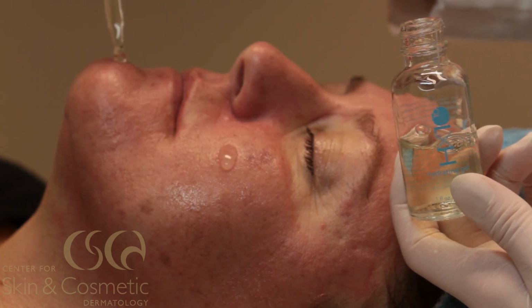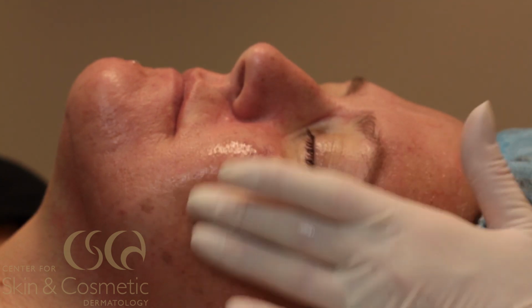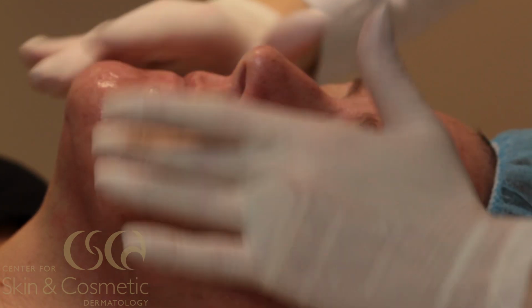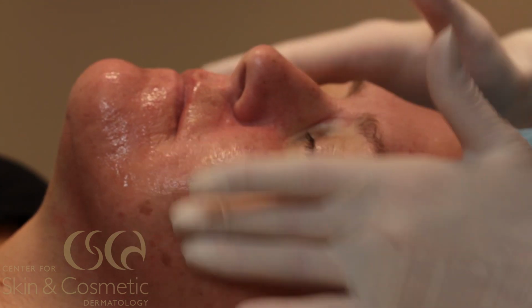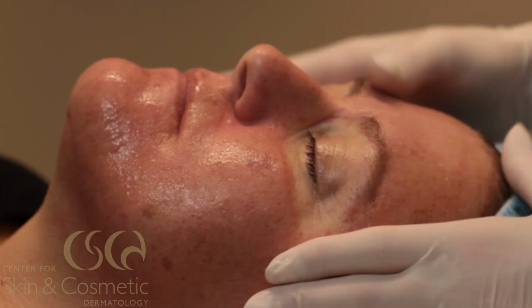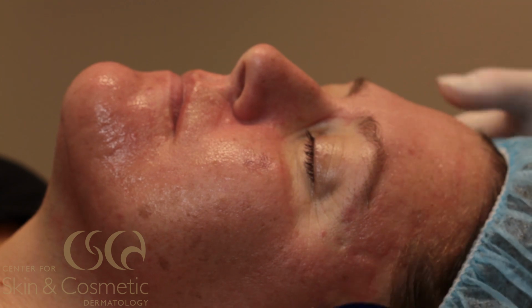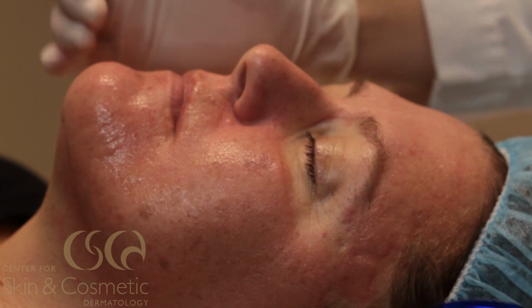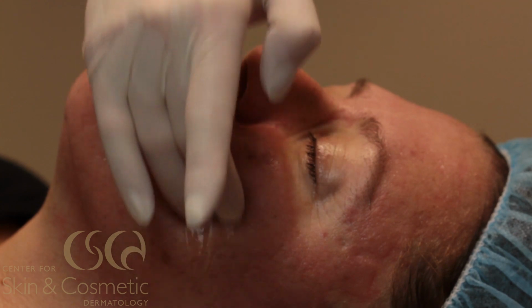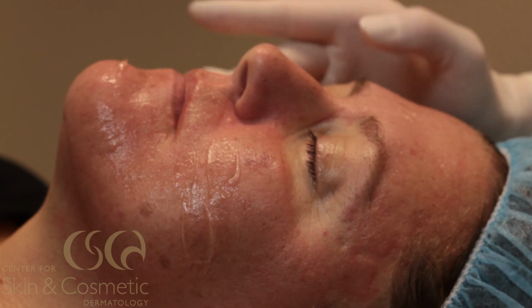Immediately post-treatment, you're going to notice a lot of erythema, which is just pinkening, redness of the skin itself. It's going to feel like an aggressive sunburn to the patient. It's going to also look like a sunburn for most patients. I find that the patients with a fairer skin complexion tend to have a little bit more pinkness or redness to their skin than the patients who have more of an olive complected tone. They may be pink for a little bit, but then the next day that pinkness has typically resolved. The patients who are very fair can hang on to that erythema or that pinkness anywhere from 3, maybe 5 days. It just depends upon how aggressive we choose to go with the procedure, or we need to go in order to achieve the results they're wanting to obtain from the procedure.